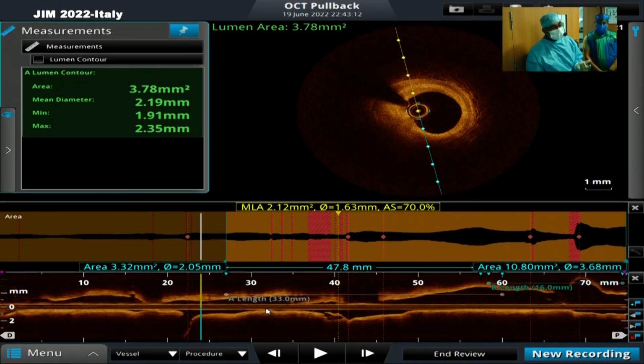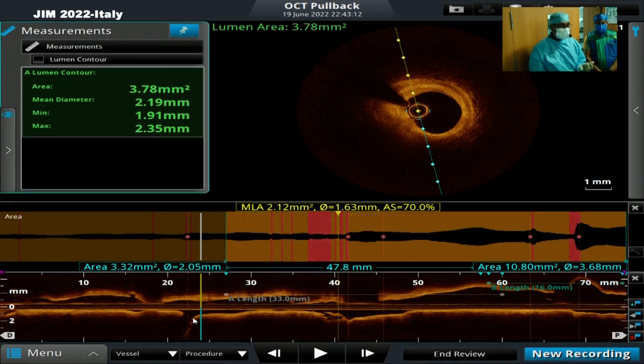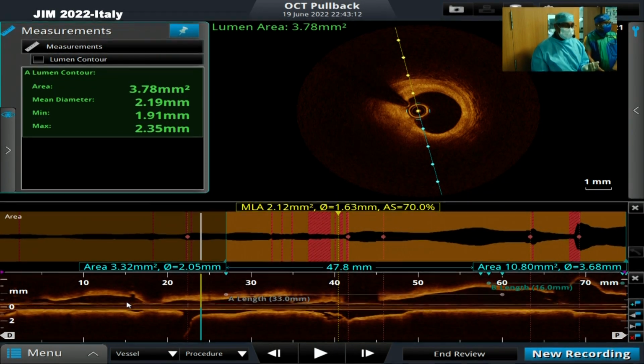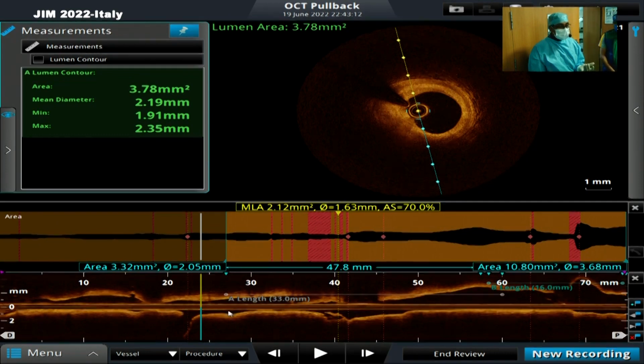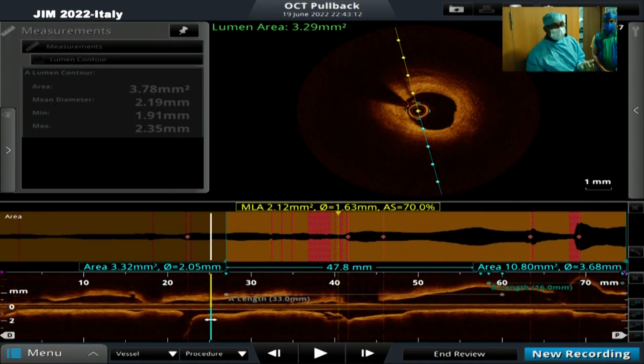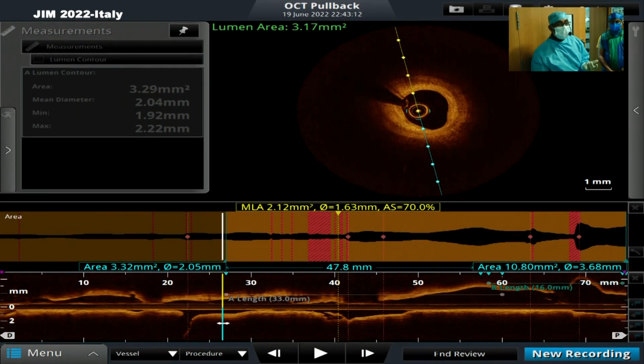So if you were to position a stent well across this particular vessel, the chances of this closing down would be very unlikely based on the OCT criteria, because the angle is a wide angle. It's not a narrow angle. The BPCT length is also good. So if at all we had to position the stent beyond this branch, we are unlikely to lose this particular branch. Well, now as we come more proximally, based on angiography, this is what we had in our mind.